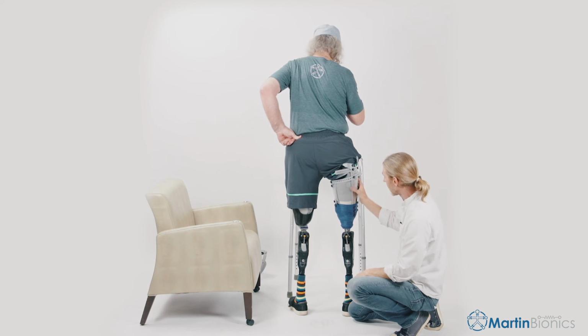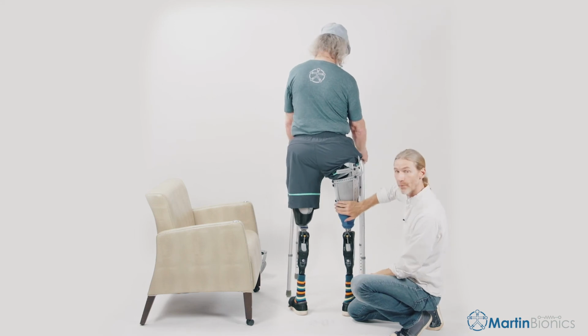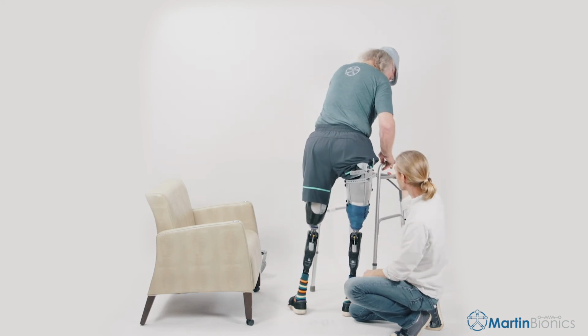So as long as the cross connectors are all tight, the proximal webbing is snug, and the two lateral struts are sitting right where they need to go, that's really most of the fitting process. So we casted this. We know this part fits intimately well. Yep, you can face back this way.